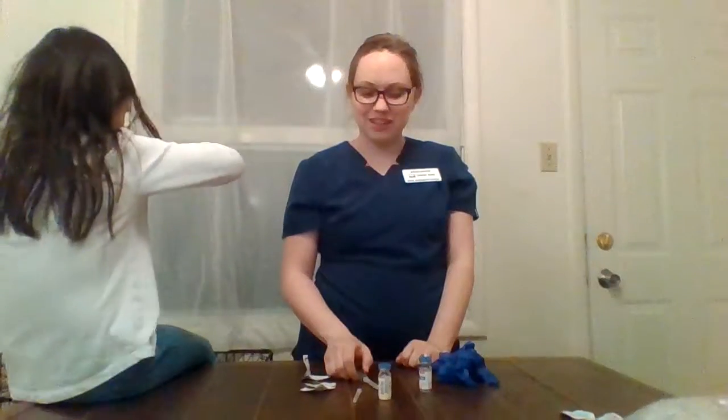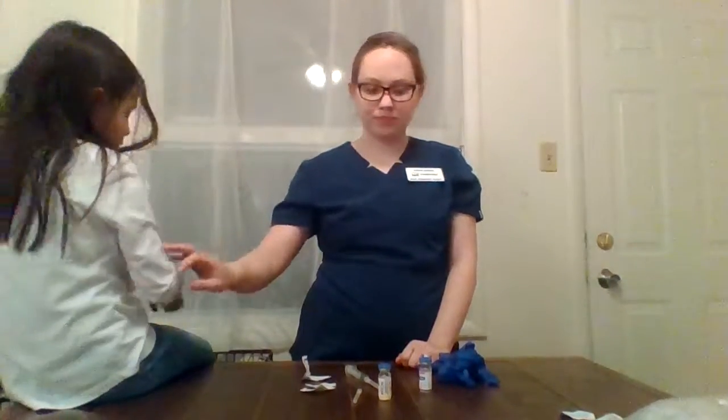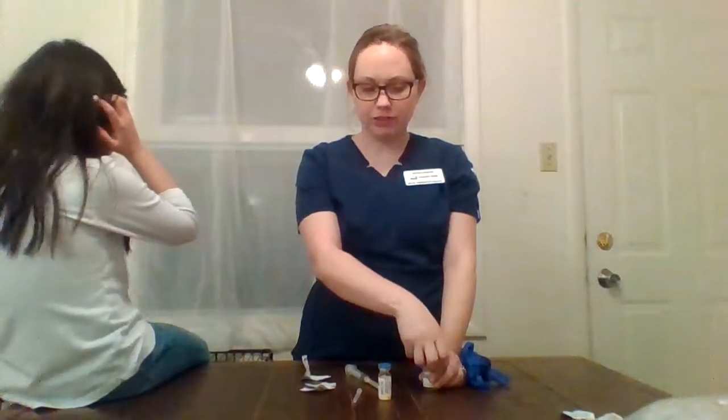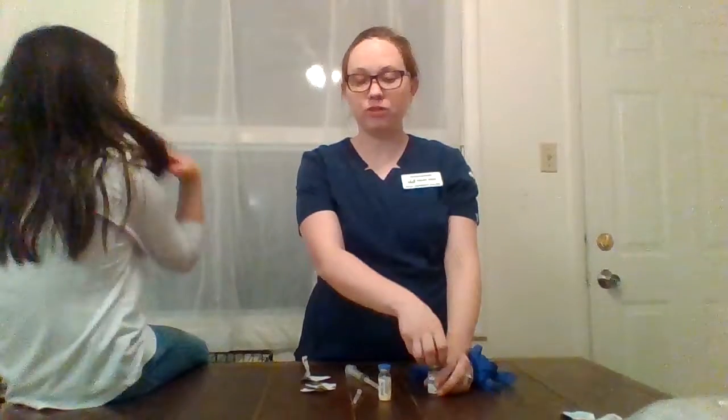drawing up 2 milliliters of medicine. For my calculation, I need to draw up 5.6 milliliters of diluent, and I've already checked that it's the right diluent for the medication.